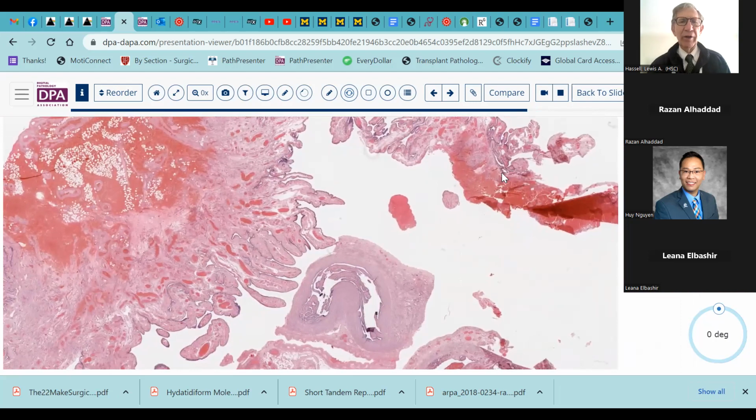Now, I remember working with new residents on this situation. Very often they would want to overinterpret, and so forth. And I think there is a learning curve here, and it's acceptable to recognize that. And so erring on the side of doing more frequent P53 stains to adjust your eye and adjust your threshold is not a bad practice when you're in that learning stage.